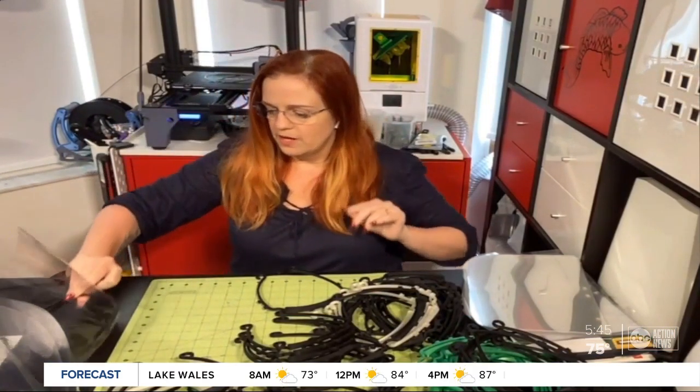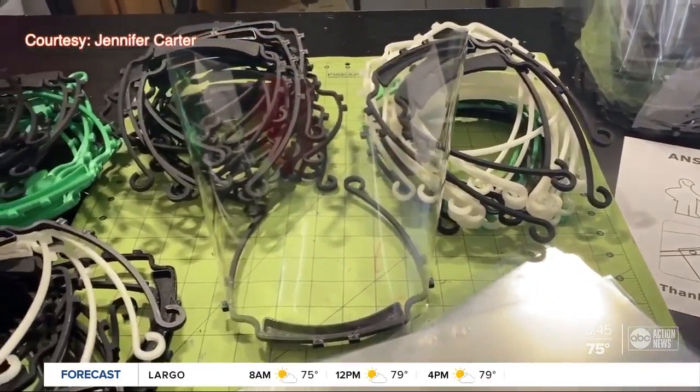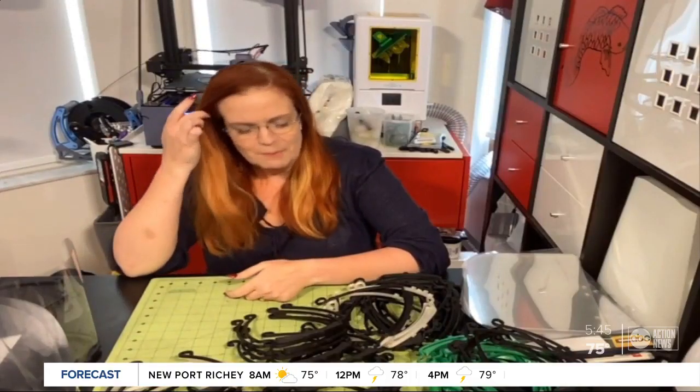Carter's friend invited her to join the Facebook group Print the Curve Flat, where hundreds of people across the country are using their personal 3D printers to create face shields for health care workers battling COVID-19. It just kind of escalated from just doing a couple online.